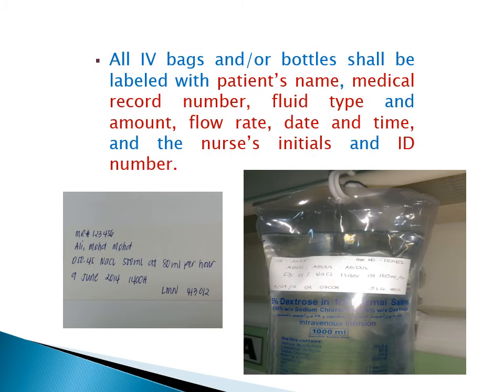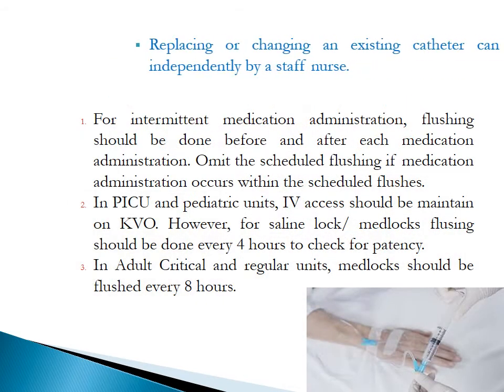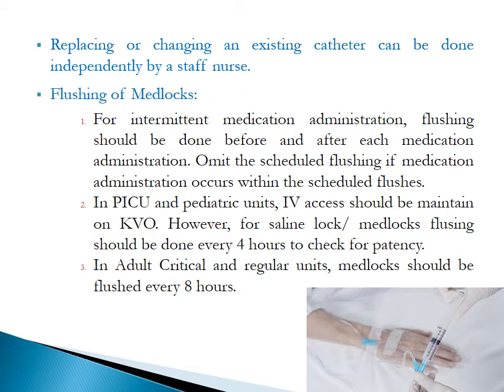All IV bags and/or bottles shall be labeled with a white sticker, indicating the patient's name, medical record number, fluid type and amount, flow rate, date and time, and the nurse's initials and ID number. Replacing or changing an existing catheter can be done independently by a staff nurse.